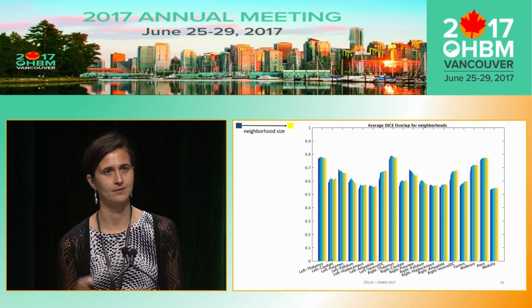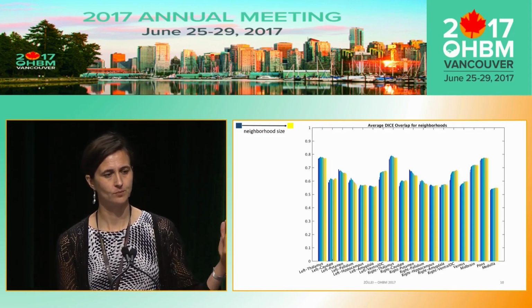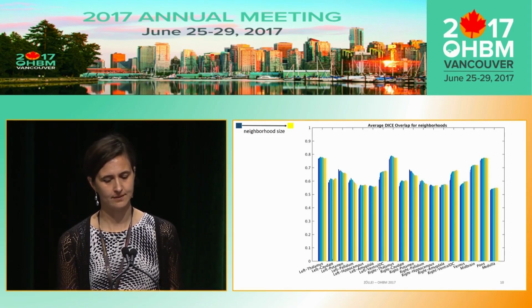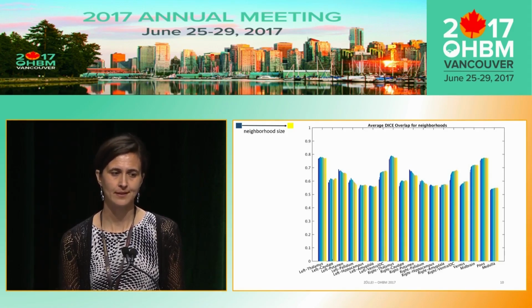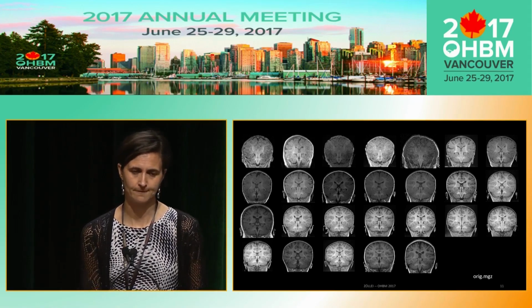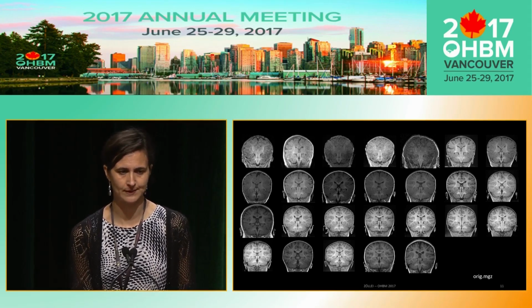As I mentioned, we have 26 manually segmented labels. With the blue colors, we are using a small set of this full training data set, and yellow indicates that we are using the full data set. At this point, the recommended number of training data sets is around 4 in order to optimize for accuracy and optimal performance with respect to computation.